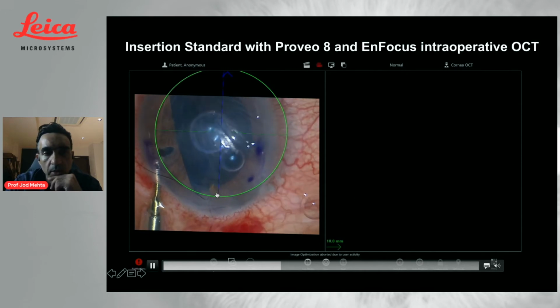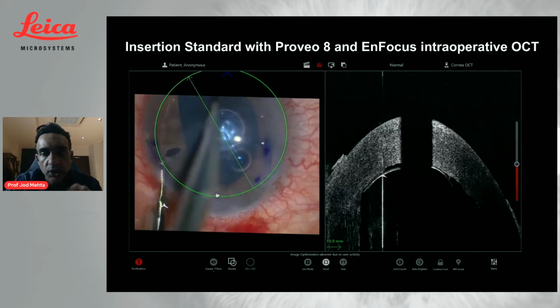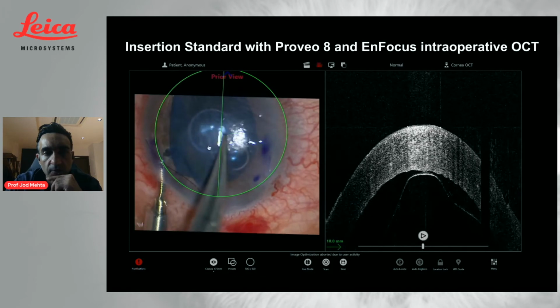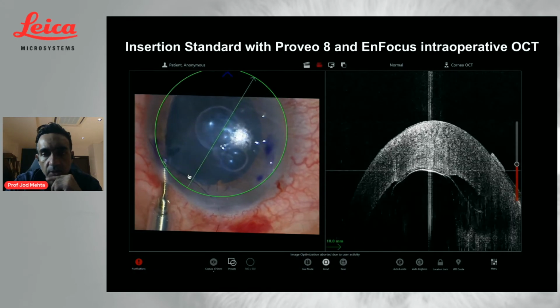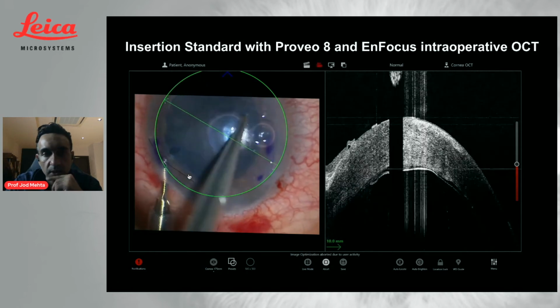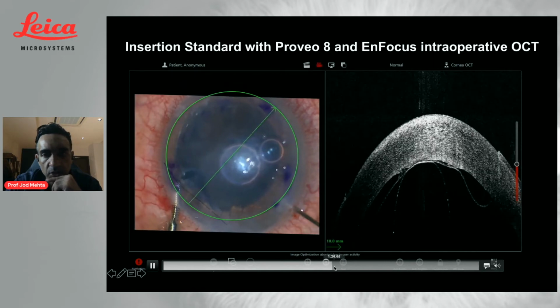And I just put a small bubble using a 1 ml syringe underneath the graft, and that's the end of the case. So the bubble is in the right position. You can check on the OCT now to show you the bubble is in the right position, and gently I just use a little tapping motion to move the bubble to the side to open up the rest of the graft. Okay, and then you can see the bubble underneath the DMEC tissue, and you know the bubble is in the right place. And then you can just put a full air tamponade in. Okay, so the positioning is good.